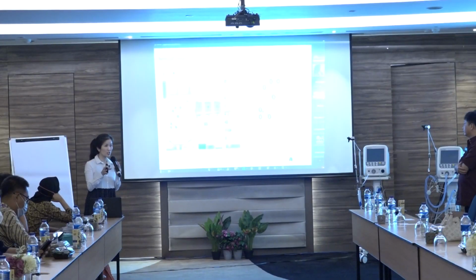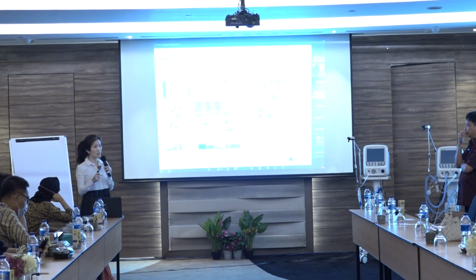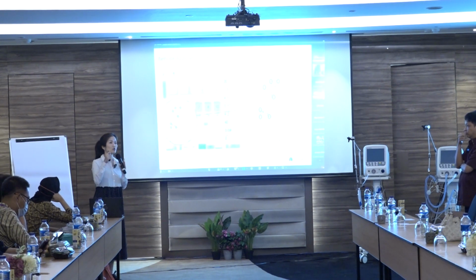But of course, if you think that the patient is unstable, or the lung is more inhomogeneous, and you want the patient to be on this PEEP level or mean airway pressure for a longer time before you do an assessment, then you can make it longer. Otherwise, if you want to do it fast, around 5 to 10 minutes you can finish, if the patient is quite stable and you get very reproducible results. So there is no strict time for that. No strict time, it depends.